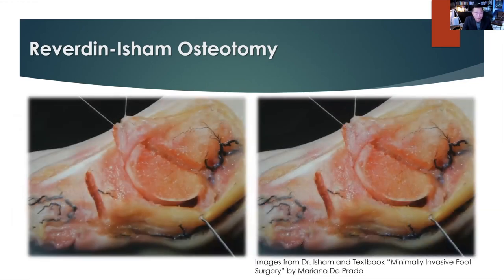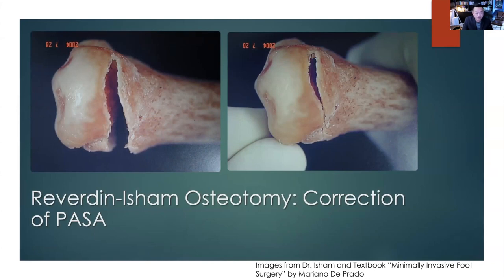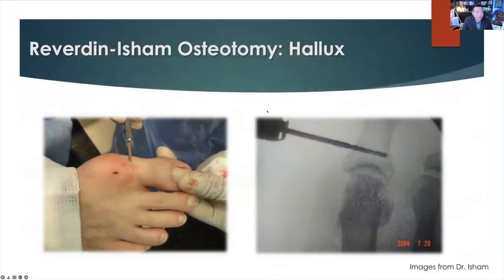Another cadaver lab demonstration of how the osteotomy was performed. And this demonstrates how it corrects the PASA angle by wedge osteotomy. You're looking at the AP view of the first metatarsal. Because of the wedge, when they compress, it corrects the PASA.